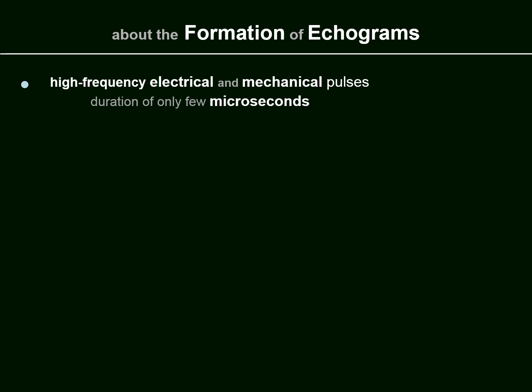Now the formation of echograms. The high-frequency electrical and mechanical pulses have a duration of only a few microseconds.